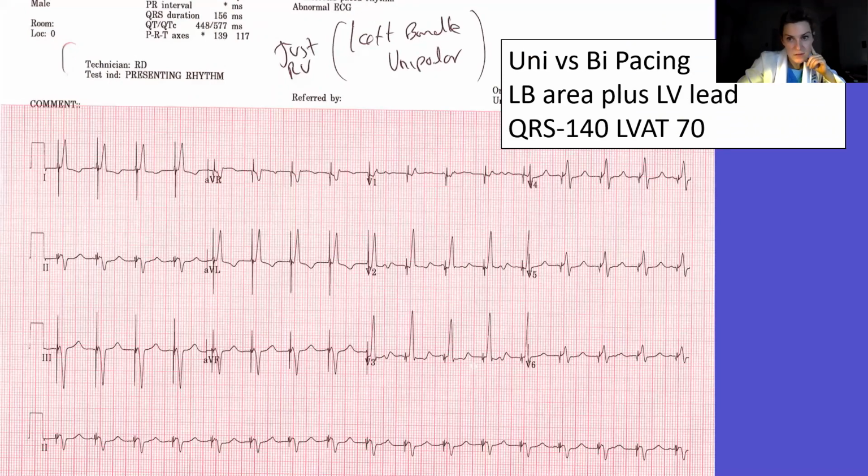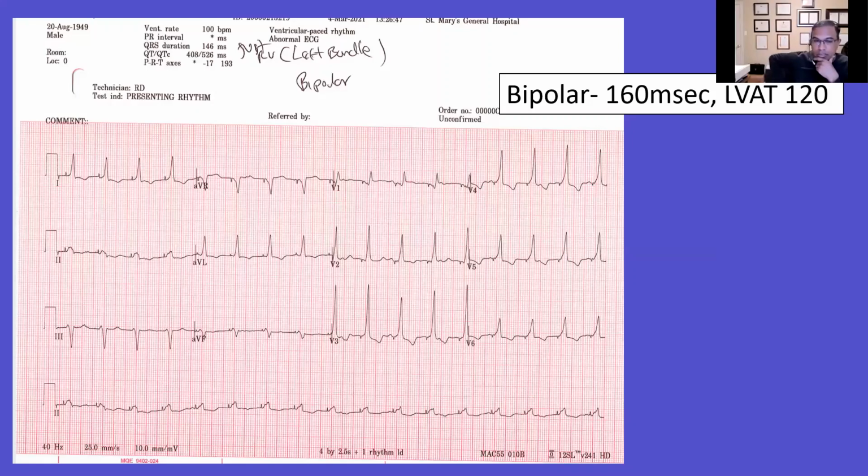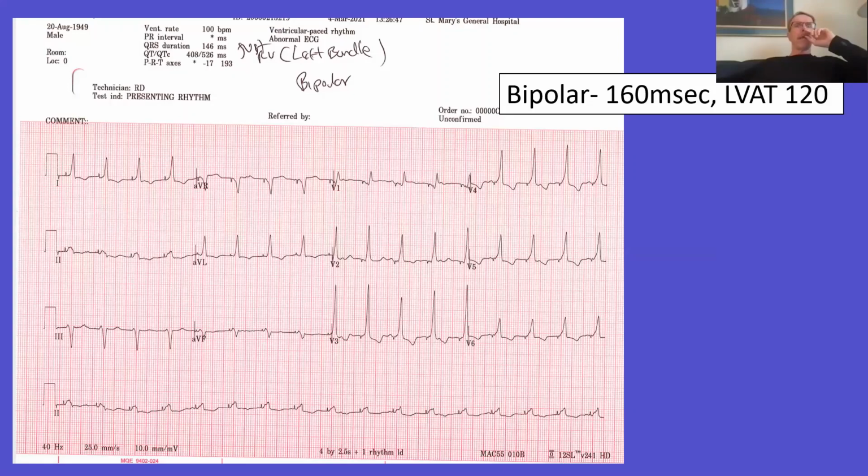So that's unipolar, and this is bipolar. How deep was the lead, Klaus? Was your ring in the septum as well, or was your ring a little bit outside the septum? I must admit, I didn't recognize this till this follow-up ECG.